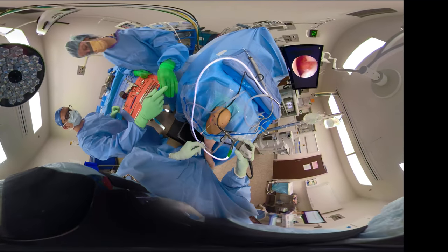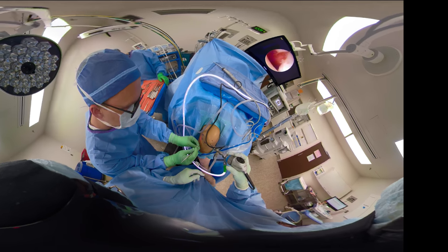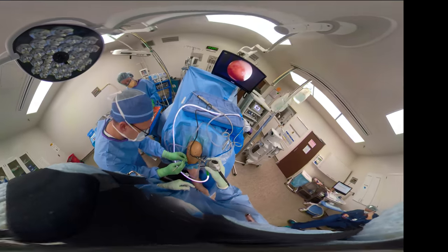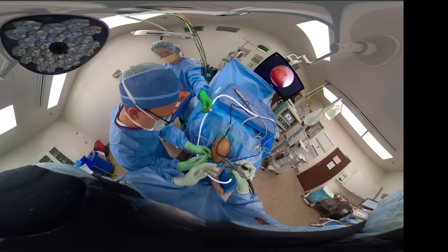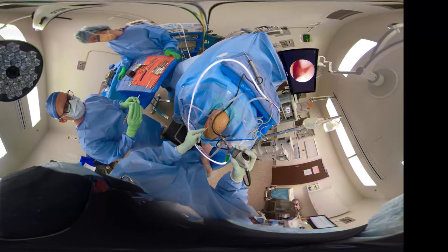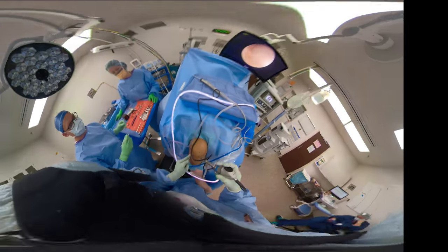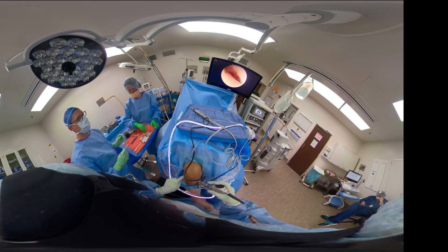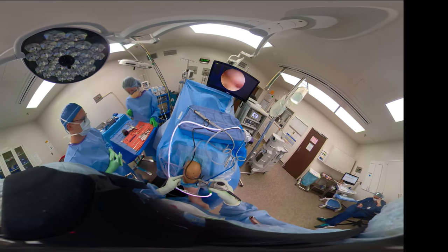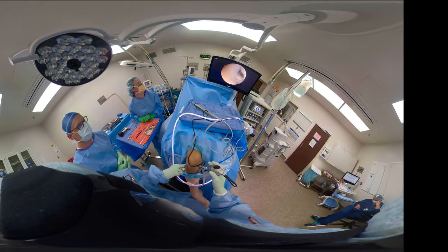We can still clear the tibia and get a perpendicular approach to be able to do the microfracture with 0.045 K wires. So we'll get our drill here. So he's just going through the skin with that. And we can use a cannula like that. We're just using the blunt so we can get the soft tissues dilated enough to make it easy to get the drill in there. You can use a cannula if you want to, but usually you can just freehand this and drill it in that way. A little easier to change the angle of your drill and pin.